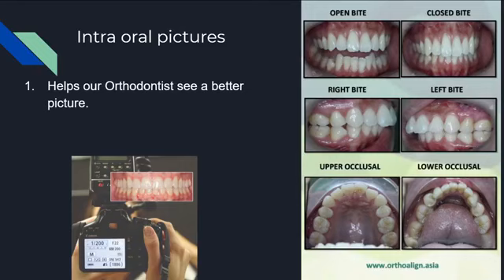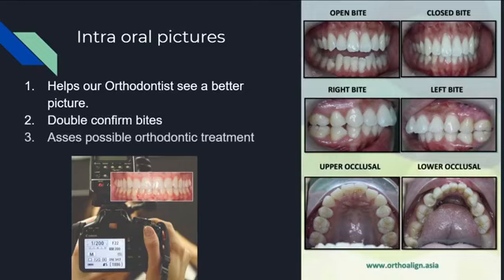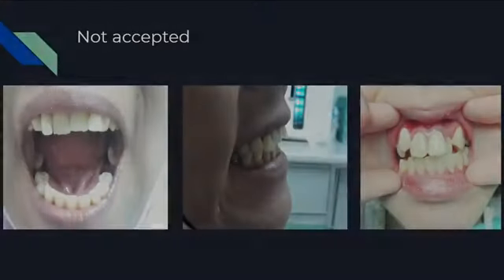You also want to use these pictures. It helps our orthodontist to see better, helps to double confirm the bite as I explained earlier, and with these photos our orthodontist can also assess the possible orthodontic treatment for your patient.